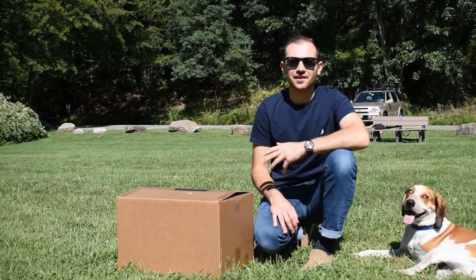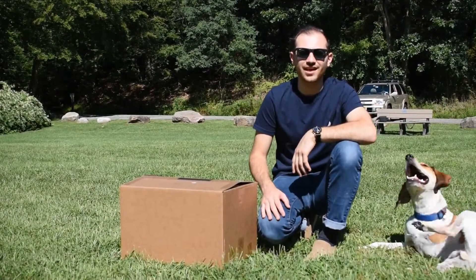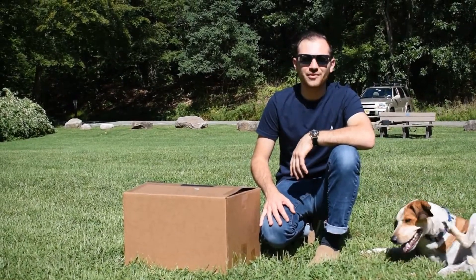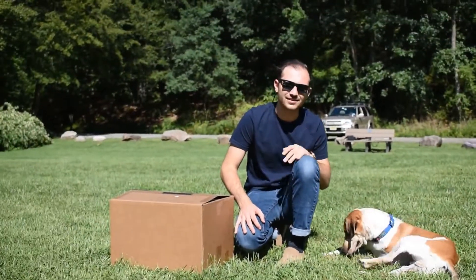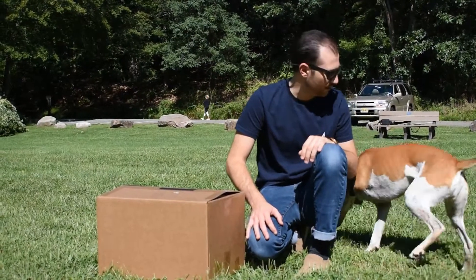I'm Alex, and I'm going to take you through what it's like getting your prosthetic, pulling it out of the box, putting it on, attaching the leg, and so on. I've got my buddy Jack here with me today — he's been a lovely volunteer. Jack has been wearing a prosthetic now for a couple of weeks, so he's definitely used to it.